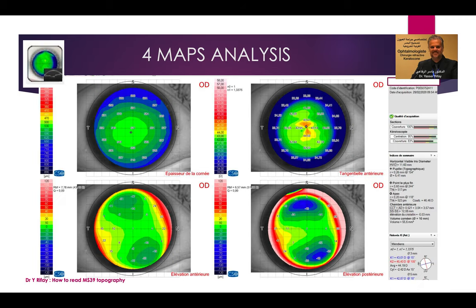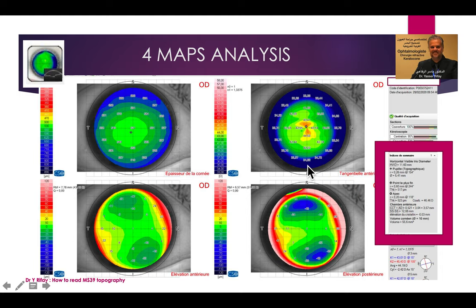Four maps analysis is the standard display with the thickness of the cornea, the anterior tangential map, and the anterior and posterior elevations. With this four map format we have numeric data, and we will start to analyze the numeric data before analyzing the maps.